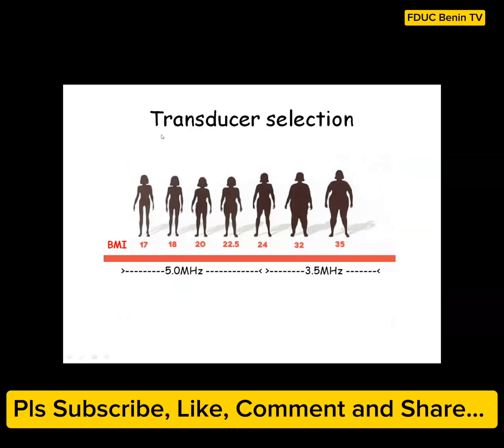For example, that low frequency probe is in a range of 3.5 to 5 megahertz. And depending on the BMI of the patient, you can actually select the frequency that you will use. So when you are scanning a patient, you can go to that knob and select. If you have a patient who is very slim, you can use a frequency of 5 megahertz.